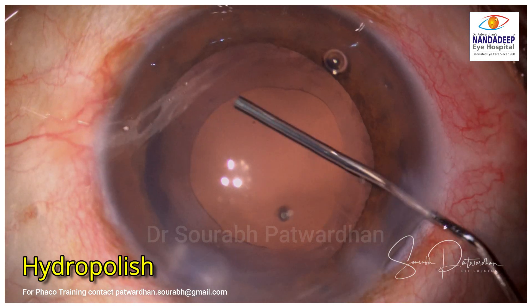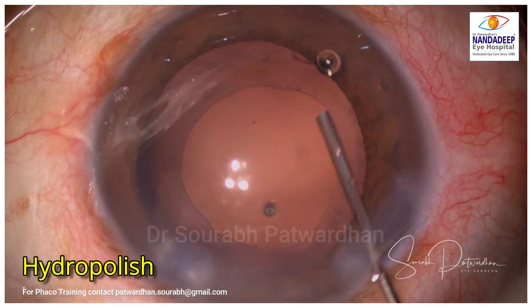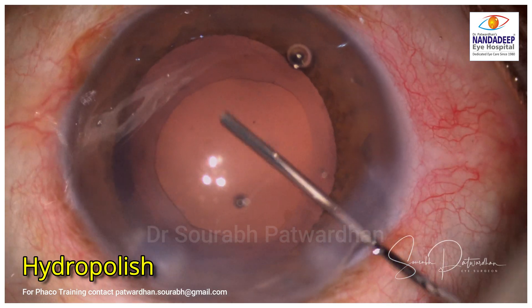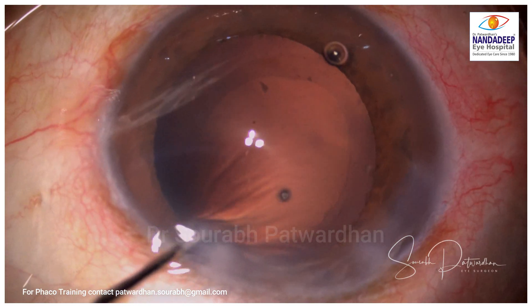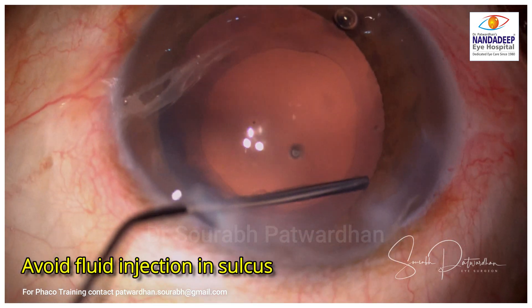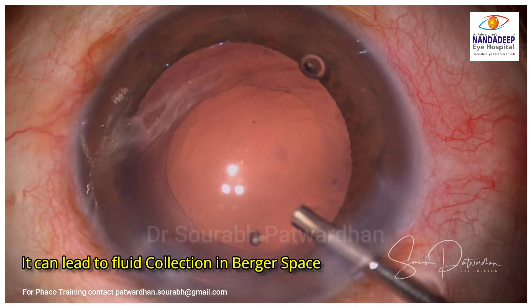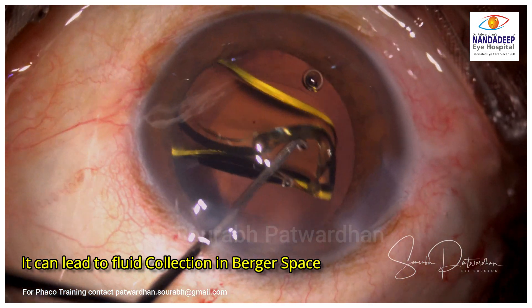When you have a good microscope with good retro-illumination you can see it even more clearly. Another method I use is hydro-polish, which basically uses a 27-gauge cannula to forcefully push fluid into the equator of the bag. That removes a lot of cortical fibers, as you can see. You can also go from the side incision. Just make sure you don't fill the chamber and make it too tight — push the fluid with force into the equator, but make sure you don't push it under the iris because it may cause fluid misdirection and increase intraocular pressure.